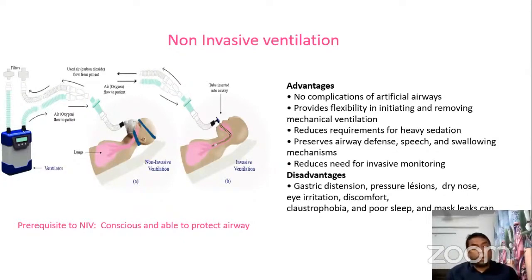There are also some disadvantages. It can cause gastric distension, pressure lesions over the face, dry nose, irritation, and discomfort. Some patients have claustrophobia, and sometimes there may be a leak around the mask, and it is quite irritating for the patient.